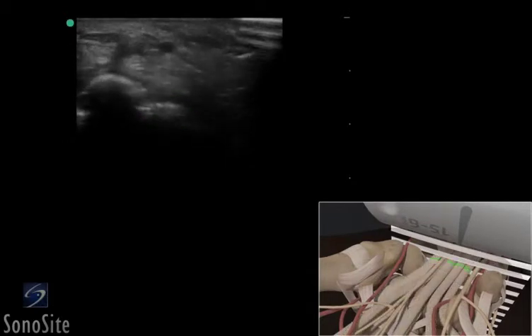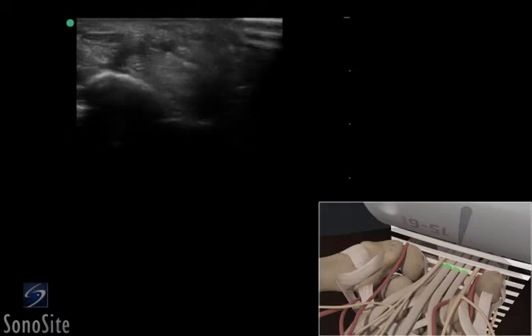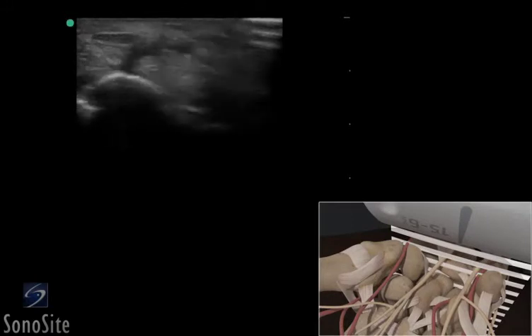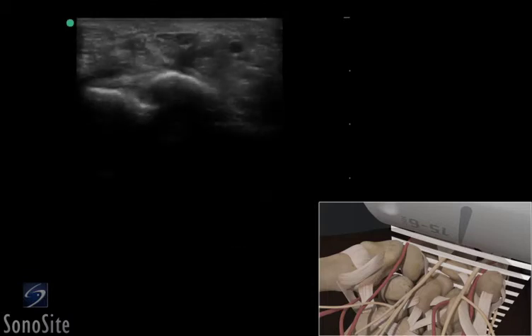The superficial and deep tendons of the wrist can be seen as light gray oval structures that are highly subject to anisotropy. The ulnar artery and nerve can be seen in Guyon's canal superficially and on the medial surface of the wrist.